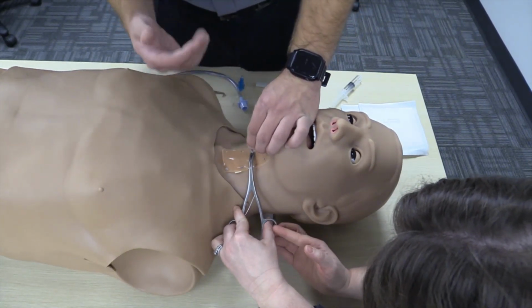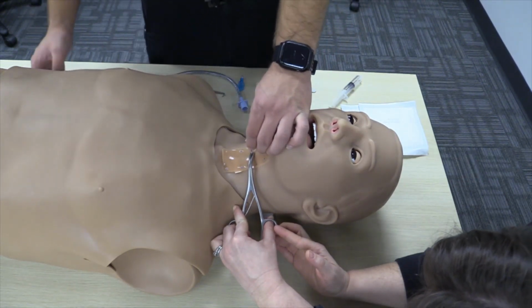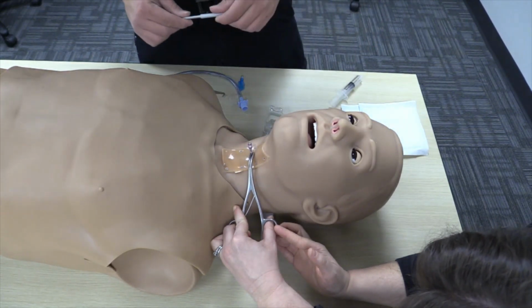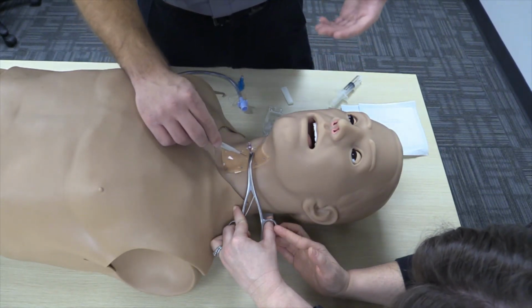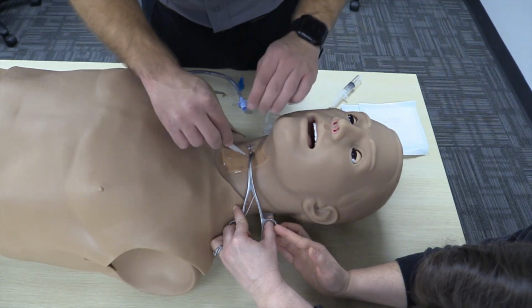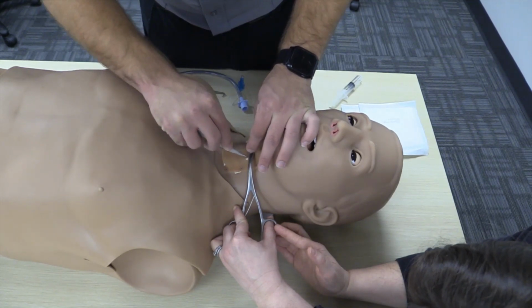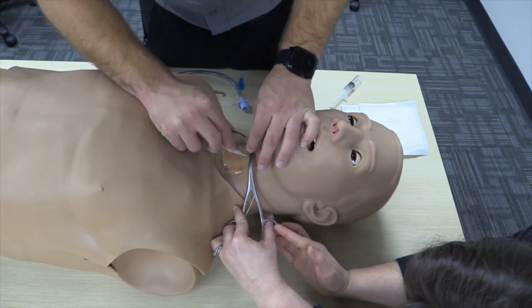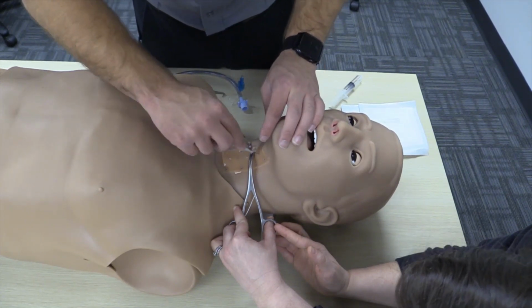Make sure that you're applying your forceps upside down, as you see Chastity doing here. You can use a firefighter, your EMT, or whatnot to actually do this. After we've done that, we're going to cut about an inch below and above with our scalpel here. Make sure we're not using a sawing technique. We're simply cutting through, trying to pierce. And then we're going to come in above as well.